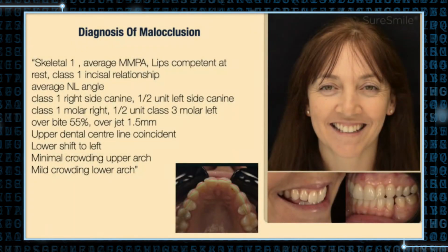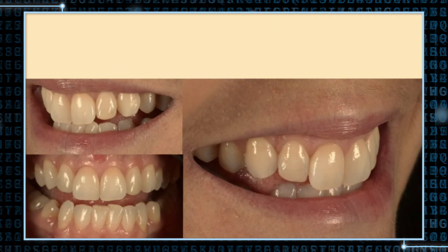It's not going to be a perfect end result. She isn't looking to treat the molars at all or change anything at the back. She's really fundamentally aiming and trying to improve the upper anterior and lower anterior aesthetics and function as well. So these are minor movements.